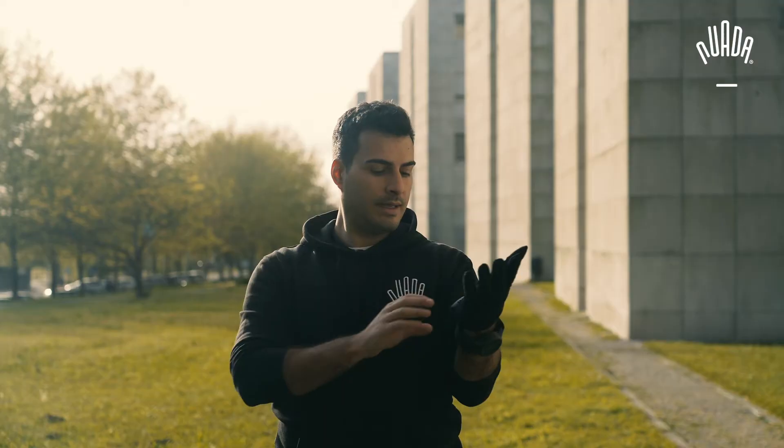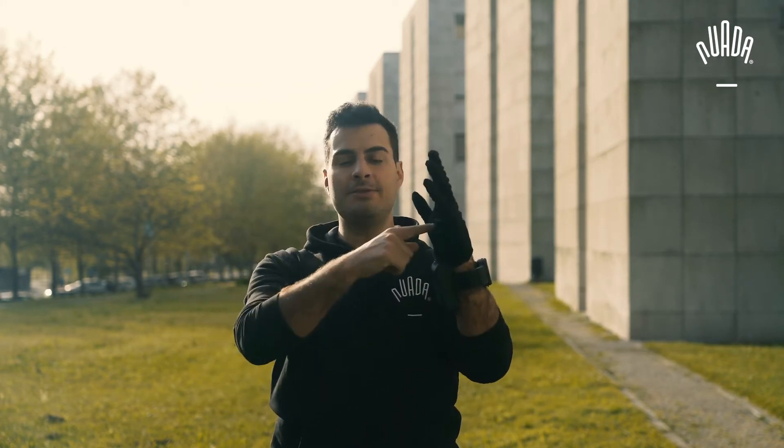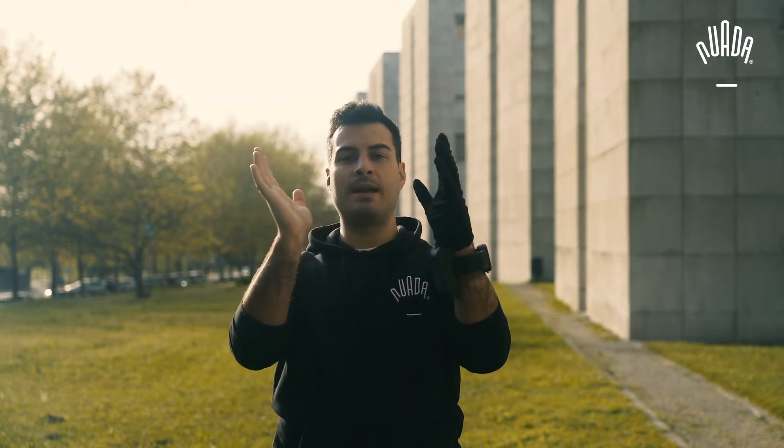How does this system work exactly? Most of the time it looks and feels like a normal glove and this is how you use it. However, when you want to hold something that's heavy you need to tell the system that you need some support. Basically in this version you bend your wrist back a bit like this, and now the system actually helps me close the hand. Because each finger is controlled individually, I can hold whatever I want.